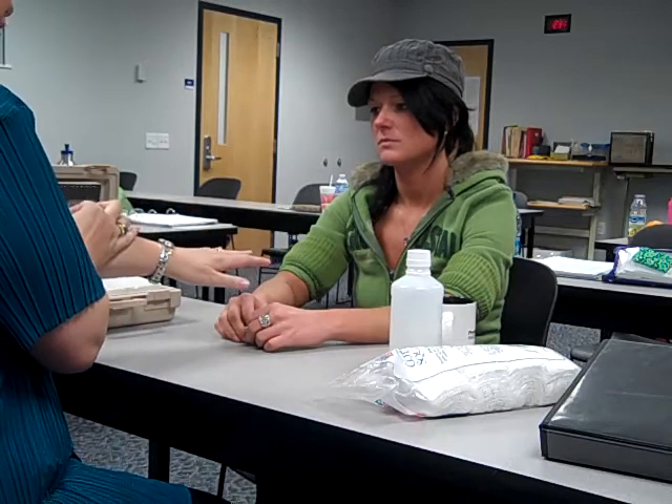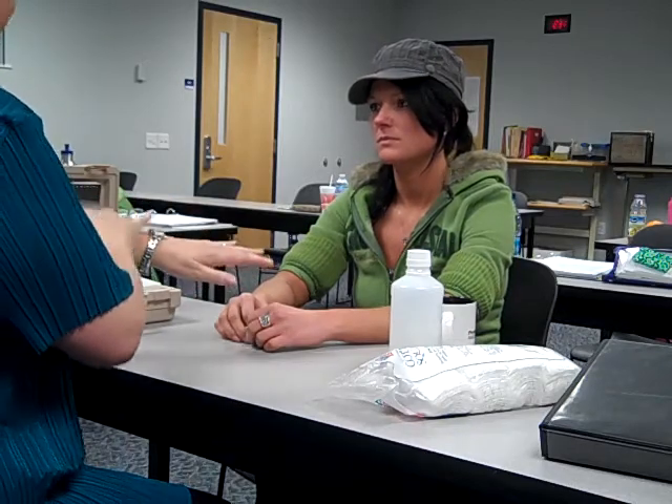Hi patient, how are you today? I'm good, how are you? I'm alright. My name is BJ, I'm from physical therapy and I'm going to be getting this TENS unit ready for you today. TENS is Transcutaneous Electrical Nerve Stimulation, which means we're going to have some electrodes on your skin that are going to cause a different sensation that will make your brain think about that instead of the pain you're having.